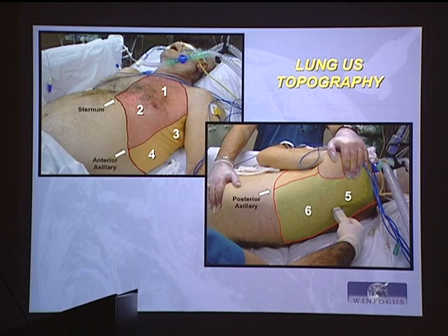Then 6 windows may not be enough, because if the focal lesion that I'm looking for is small, causing fever, so my question comes from why there is fever, and I'm using ultrasound to detect it, then it's better that I do slices of the lung, not windows, because otherwise I will miss the little pneumonia.